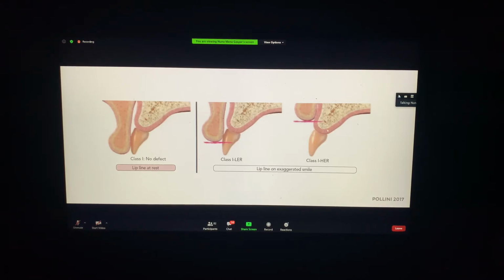And you can do it using zirconia or metal ceramic. Đối với những cái ca như thế này thì có thể sử dụng zirconia và sứ. And to do that, you will need 7 to 10 millimeters of prosthetic space.